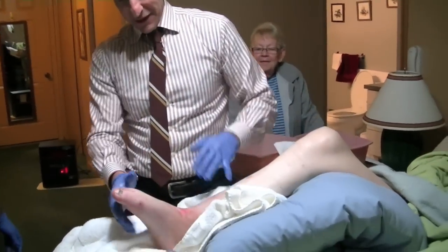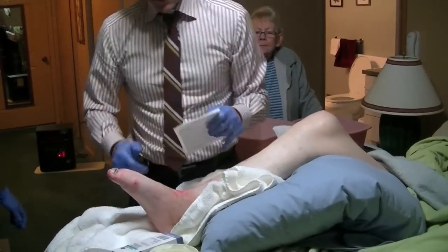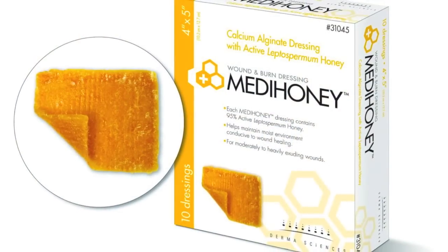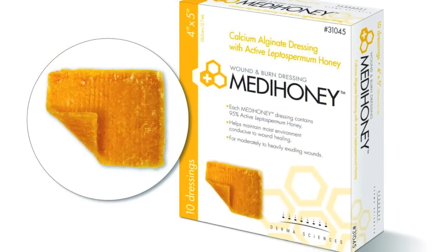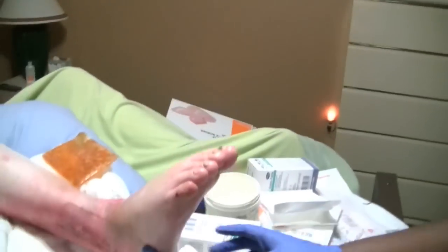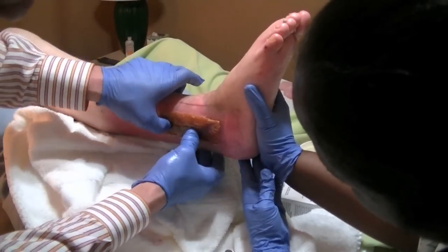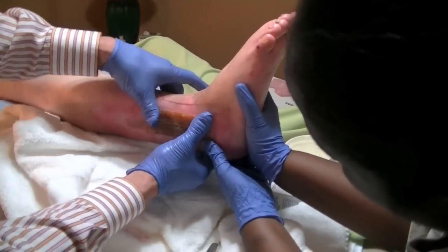So the next part is MediHoney. MediHoney is an absorbent with a high sugar content. It has been shown to be very effective for keeping the surface of the wound free of bacteria.